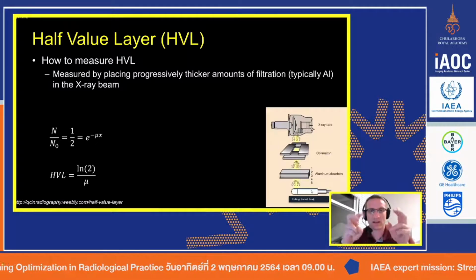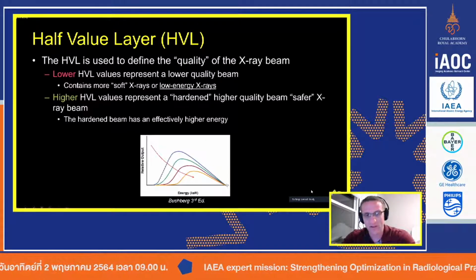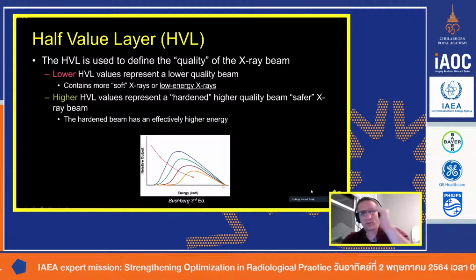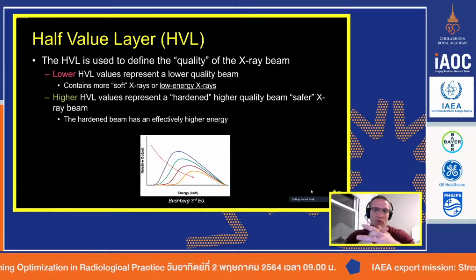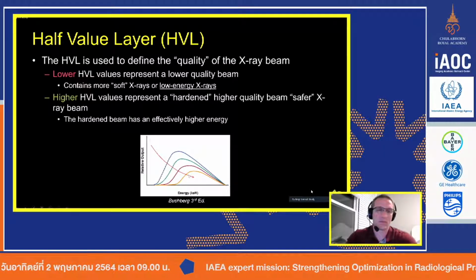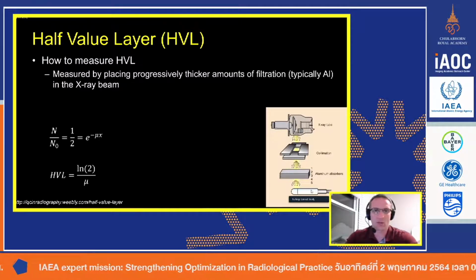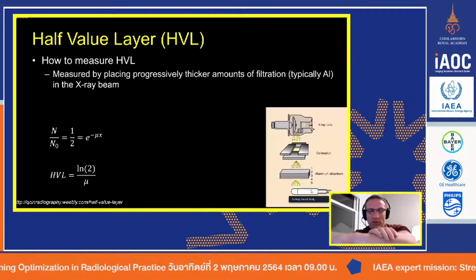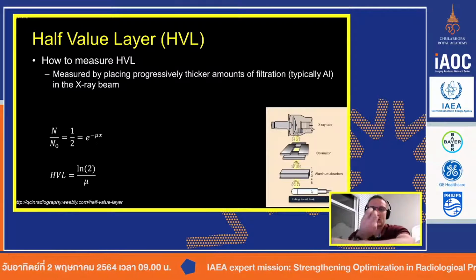It's kind of like making it a higher KV. Even though the KV value we've set is the same, we are effectively moving the contrast scale by adding different layers of filtration, which once again, when we talk COVID, we oftentimes have to shoot through doors or glass or plastic, and that is the same as adding filtration in our X-ray beam. It effectively changes the curve and it makes the beam, quote unquote, harder, i.e. less soft X-rays, less X-rays that would only be absorbed in our skin, which is a good thing. But we'll talk in a minute, because it's more penetrating, it has the ability to get into our body and scatter.